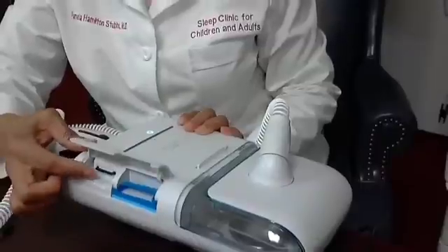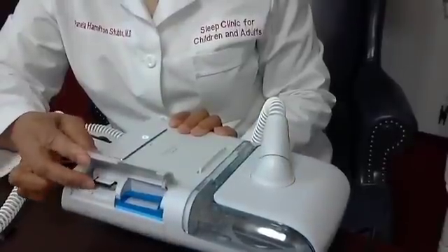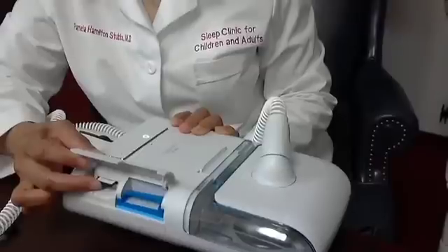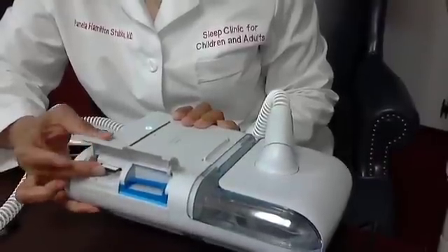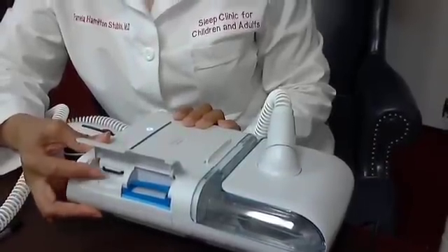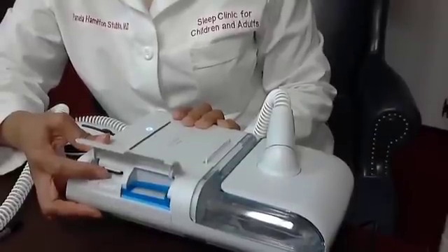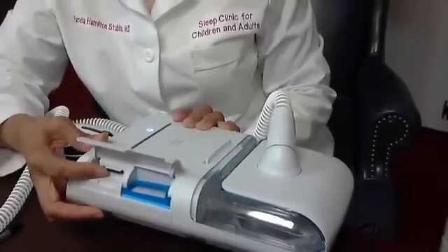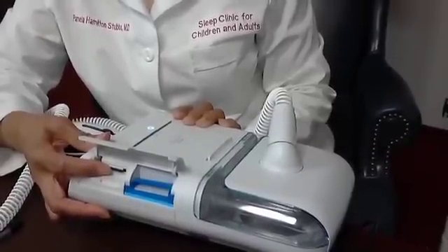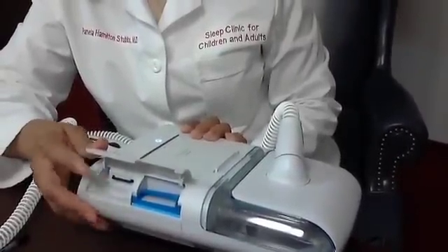Next to your filters is the memory card. This memory card pops out, so make sure it's all the way in. You'll know it's seated properly when you push it and it makes a little click. If you don't hear the click, the card may not be in, and if it's not all the way in it won't record accurately. This is what your sleep specialist or the equipment company uses to download compliance data for your insurance company.